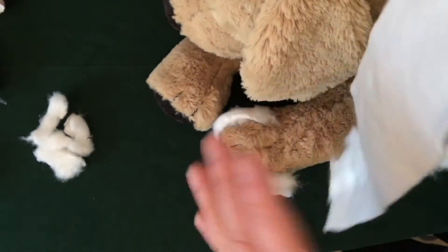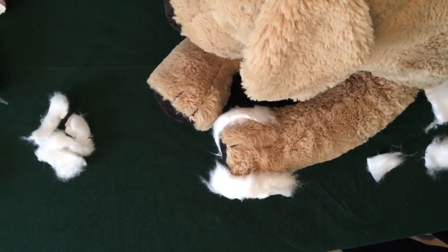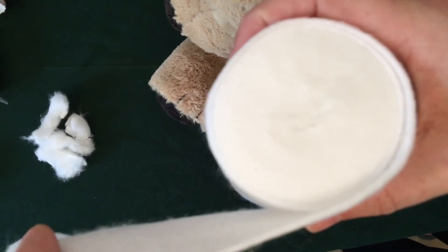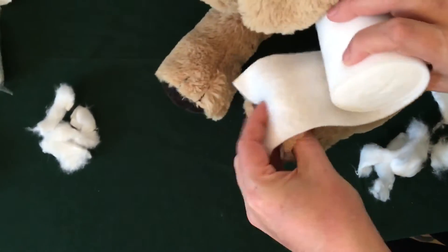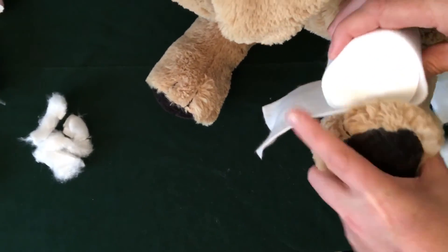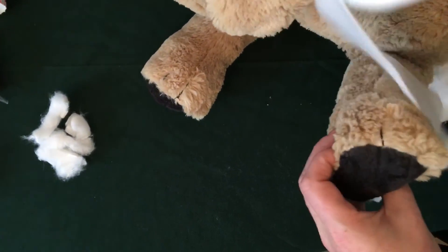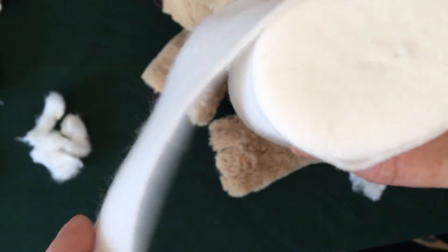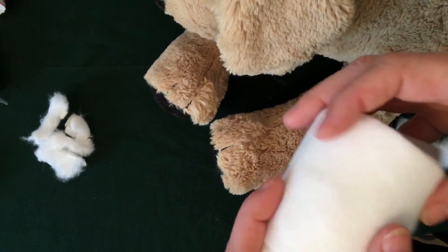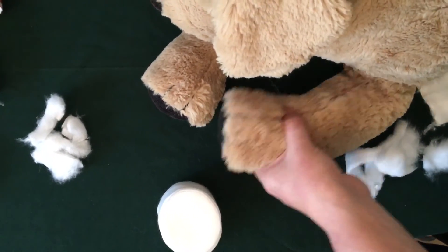Note the way I've picked up the bandage. I do still see some people doing this, and there is research out there looking at how accurate this information is, but at the moment you will find you get better bandaging if you have the bandage material on top. So that is the patient's foot — the bandage material is always going to be on top. You can go that way, or if you're left-handed you can go the other way, but we don't want to see this — because your tension is all wrong. When you get to your conforming layer, you want to be very clear that you understand what's going on, that you've got decent tension, and it's not going to fall off.